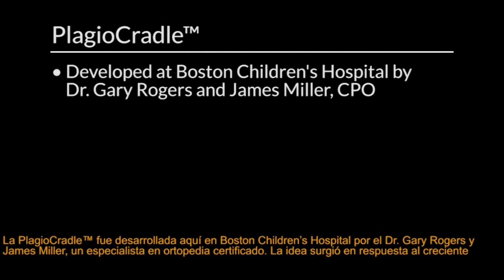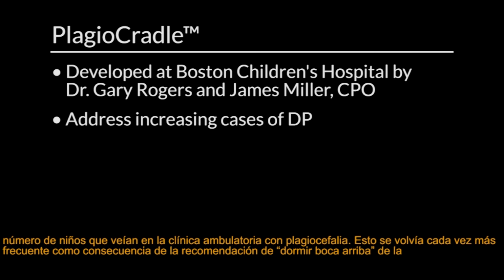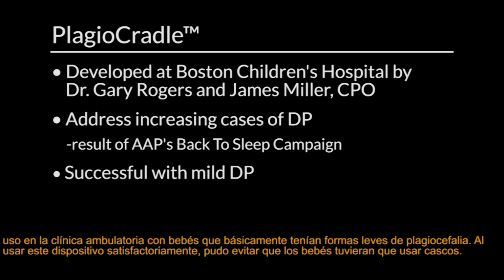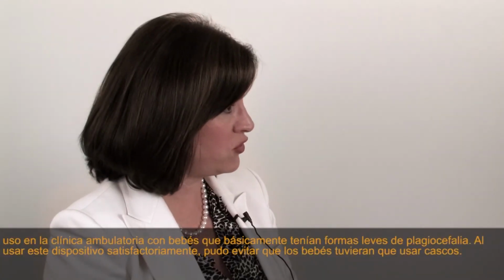So the PlagioCradle was developed here at Boston Children's Hospital by Dr. Gary Rogers and James Miller, a licensed orthotist. They came up with this idea in response to the increasing amount of children they were seeing in the outpatient clinic that were presenting with plagiocephaly. This was becoming more prevalent as a result of the back to sleep recommendations by the American Academy of Pediatrics. So together they developed this device and started using it in the outpatient clinic. And Dr. Rogers was having good results in using this in the outpatient clinic with babies who basically had mild forms of plagiocephaly. In doing so, he was able to prevent the babies from having to wear helmets.